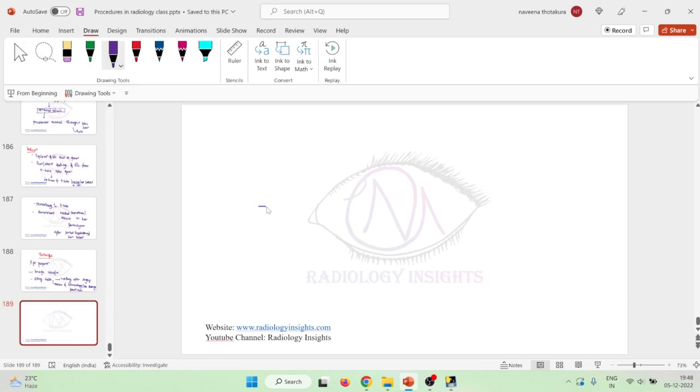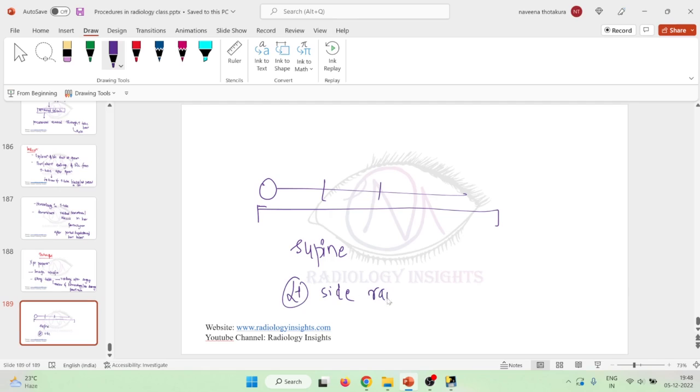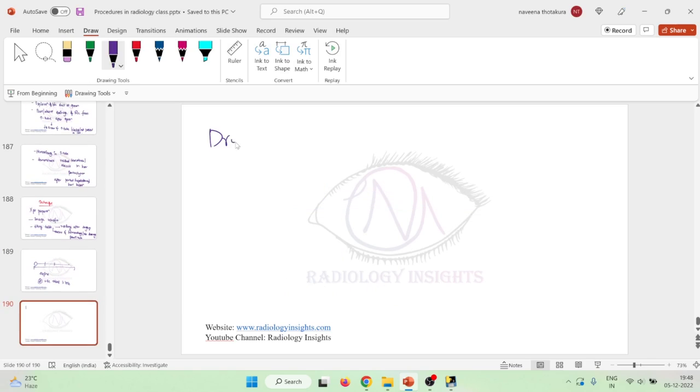Normally the patient is put in supine position on the X-ray table, and the left side is raised a little. All the dressings, or any metal objects present in any part of the liver area, should be removed.